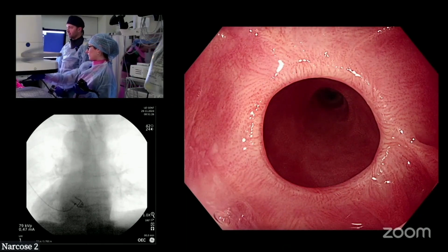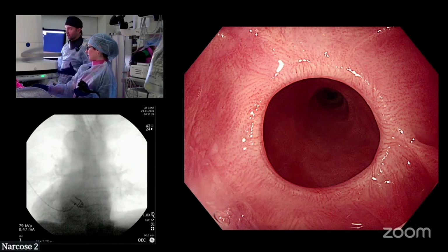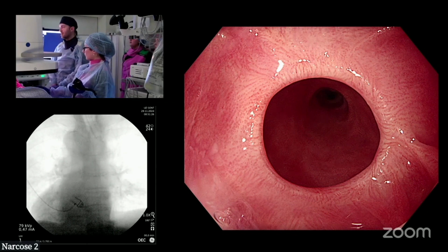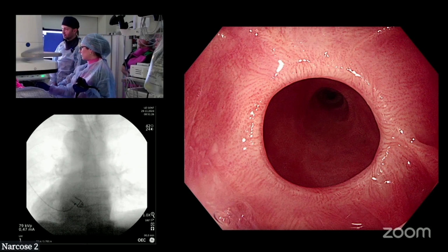So let's describe this. I think it's a fibrotic circle. It looks exactly like yesterday, remember in the Barrett's course, we talked about the nature of a scar. This is a perfect example of a scar, and in this case, it's completely circumferential. Why is it a scar? It has those fish swimming in all different directions, this capillary pattern, it's wide, and it's also in this case helpfully forming a ring. So how long would you say this particular one of the multiple stenoses in this patient is? Just this ring? Short. Yeah, very ultra short, right? Just that, nothing else.